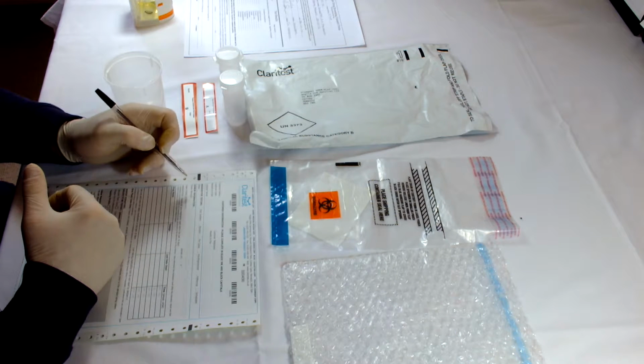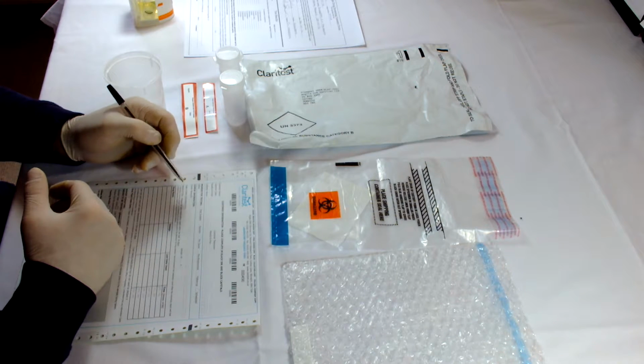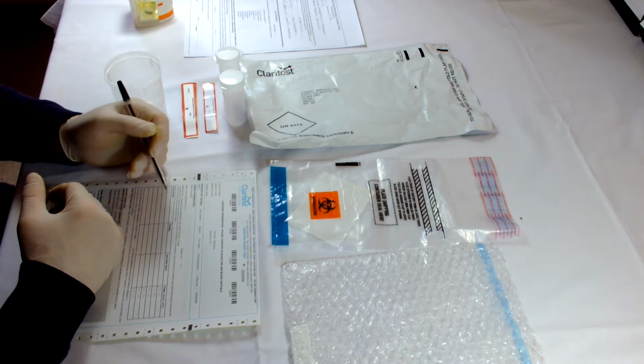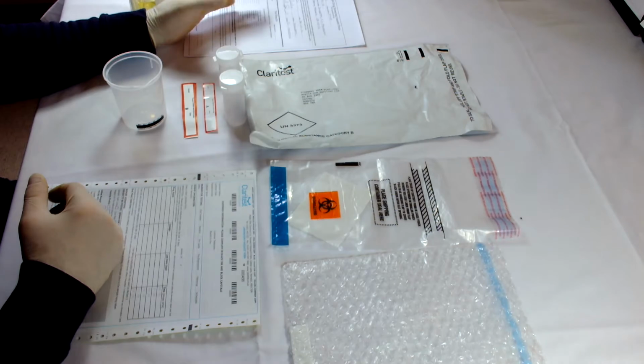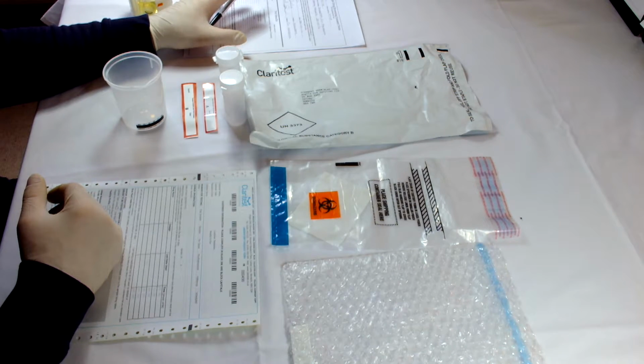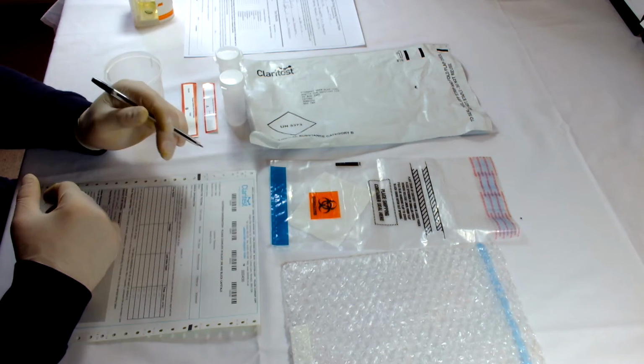We then put the donor information in here, so donor name, their full date of birth and their gender, and any medication they've taken in the last 14 days or 2 weeks, and we simply transfer the information from the initial donor consent form into there.